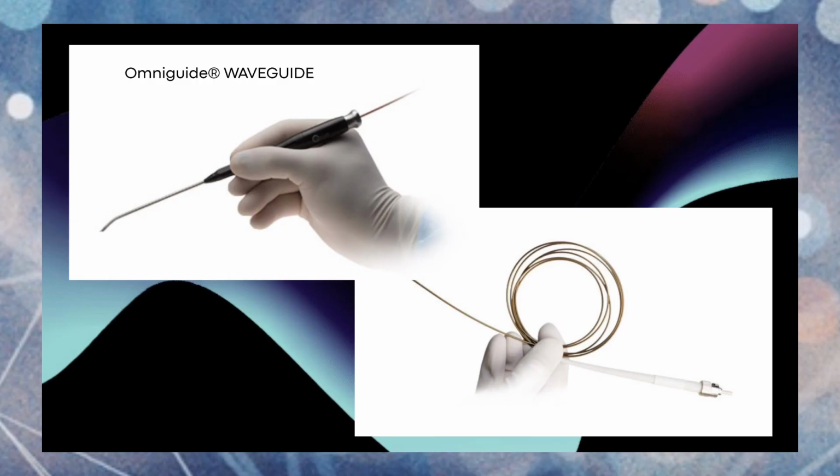But this was taken specifically, it was an Israeli company that did the original formulation, and it took from the stealth technology for jets and put it into these waveguides. The problem with this system, it's a very, very good system, but it's very expensive. So the CO2 lasers themselves are far more expensive than diode lasers.